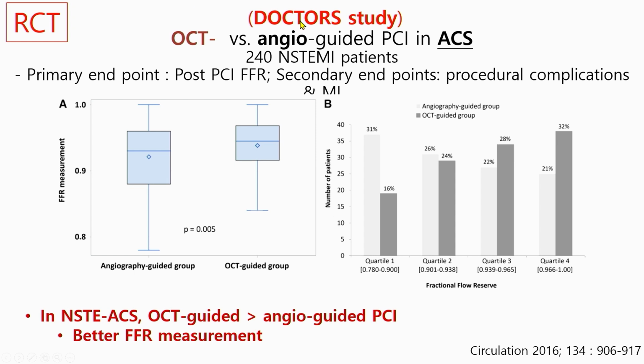For the DOCTORS study in ACS patients, they compared OCT and angio guide in non-STEMI patients. In non-STEMI patients, we can see OCT guide has a better result than angio guide in FFR measurement. It is comparable with FFR measurement when using OCT guide.